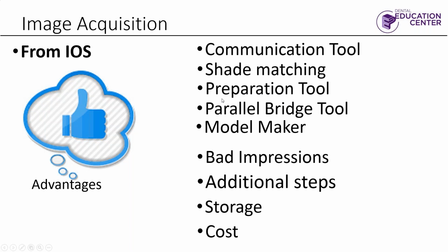undercuts. It does show distances from your opposing, so you can just measure: do I have enough room? Is my lab going to call and say, look, we've got to do a reduction, this isn't going to fit, while the patient's sitting there? And if you're working closely enough with a digital lab, you could send that intraoral scan directly to the lab. They could give comments, yep, we're good, send the patient home. That kind of instant communication is really invaluable. And so as a communication tool, I think it is really important.